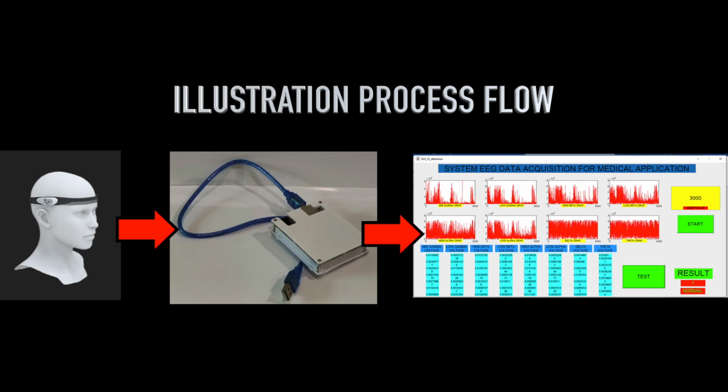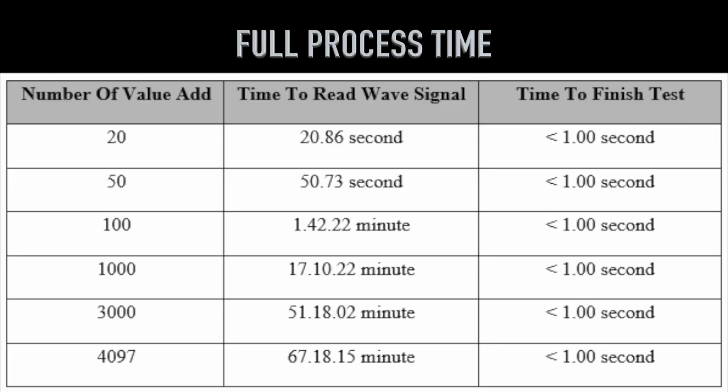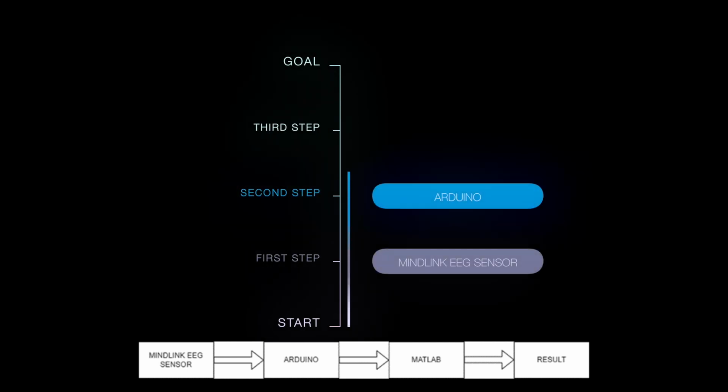GUI, graphical user interface, in MATLAB are helpful for developing interactive tools, and data visualization has been developed to make it easier for users to use the test program. As a result, a variety of methods for recording these signals and directly visualizing the graphs using the software have been created, which may then be assessed by a professional, and some observations on the functioning of the brain made.